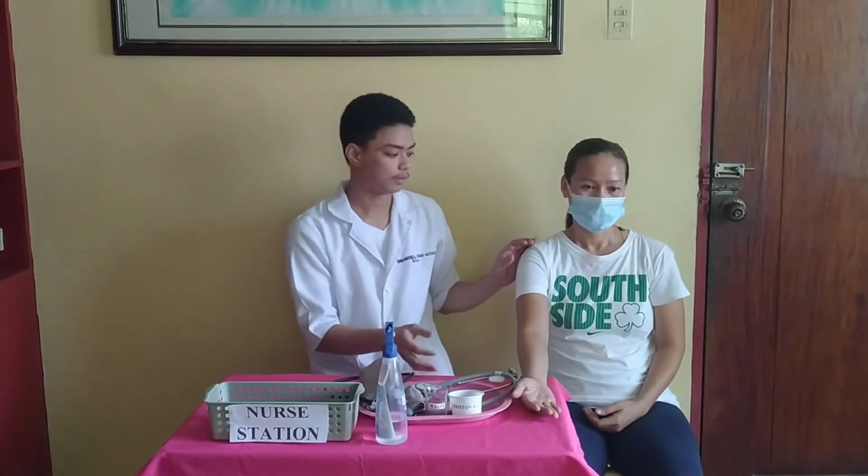Next step is place your client in an appropriate position, wherein for an adult client it should be in a sitting position, wherein both feet of the client should be flat on the floor. The rationale behind this is para po makuha po natin yung exact na reading po ng pasyente po natin. And the elbow should be slightly flexed, wherein the palm is facing up and the forearm supported at the heart level. And then expose the arm of the client.